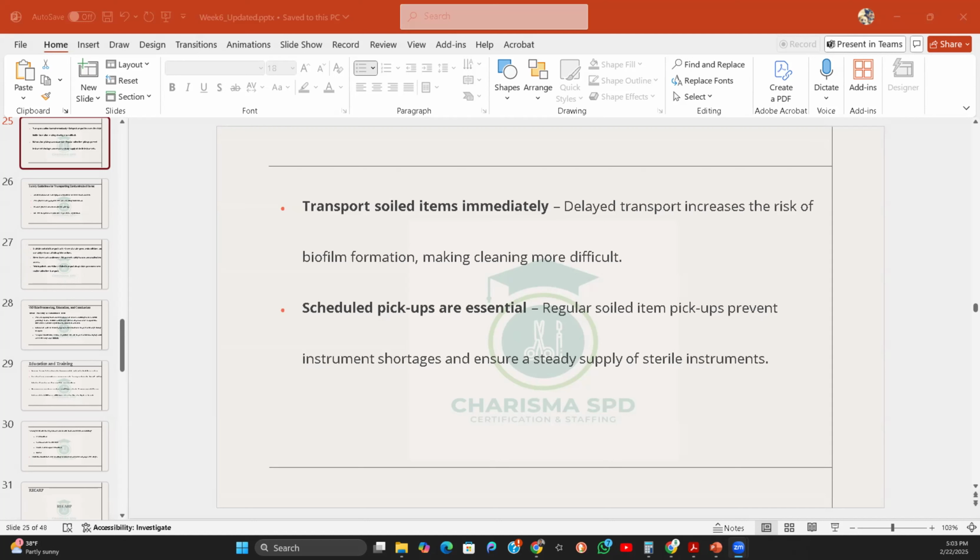Some facilities, like somebody suggested, have a chemical wiping chemical. They wipe it down. Per the hospital policy, it is still safe to use it to transport, but it is not ideal. The best option is to decontaminate the cart by passing it through the cart washer, okay, so that it is safe to transport the instruments.